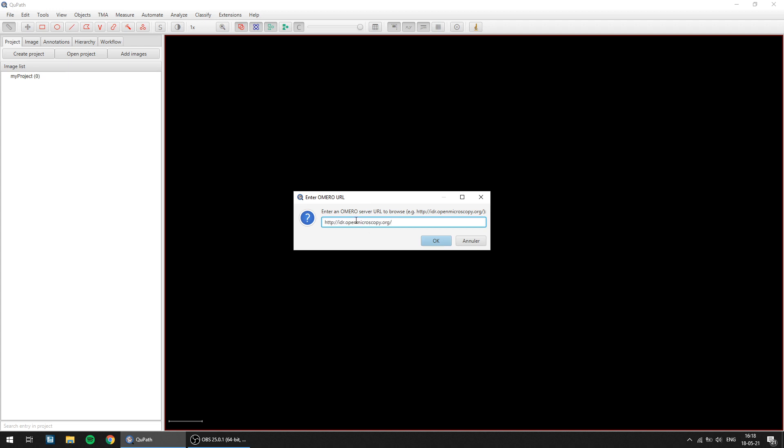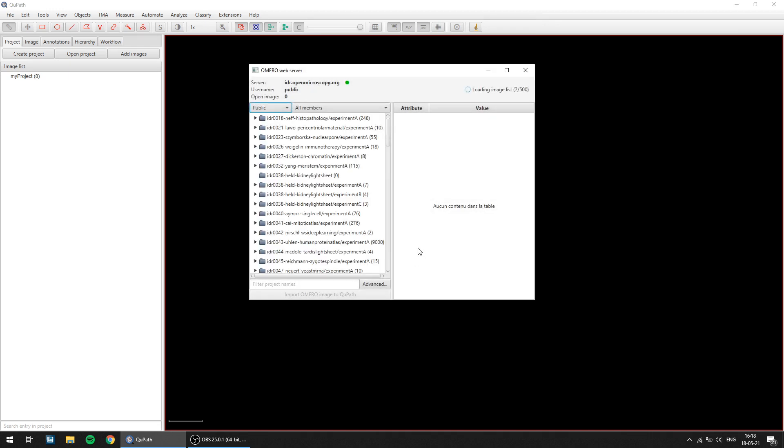I've taken here the IDR as an example, so that's a public server, but obviously it also works with private servers. So you click OK and through the Omero JSON API, QuPath will fetch all the information displayed quite nicely here in this window.